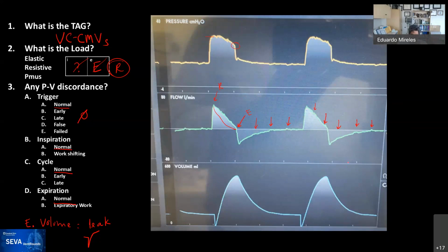Well, obviously some clinical context would be helpful. My assumption in this case is this is either someone that has COPD with a pneumothorax or ruptured bleb, or someone that has undergone an endobronchial valve with a pneumothorax as well. In order to maintain gas exchange in someone with increased resistance, I would try to decrease the respiratory rate a little bit, to make sure they don't develop any further leaks, and maybe also reduce the volume that's going through the pneumothorax. And remember that would be a pneumothorax with a chest tube. Yes, with a persistent air leak through the chest tube.